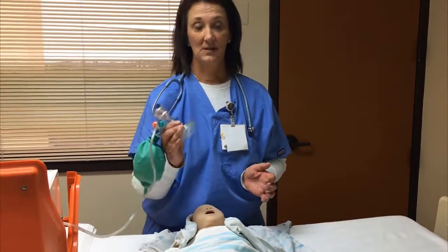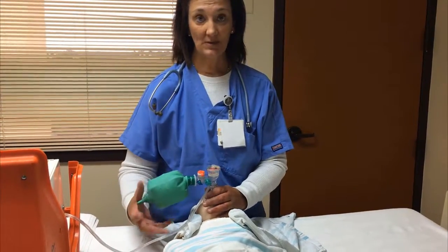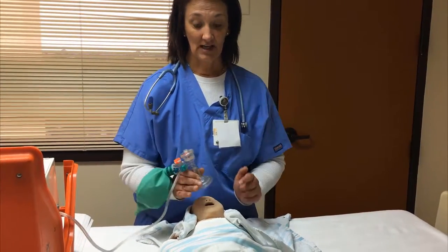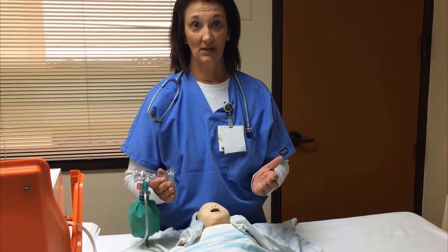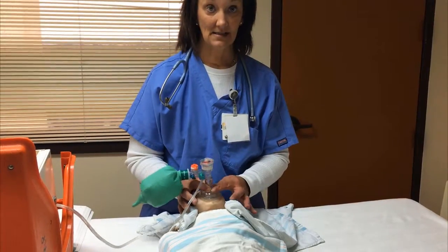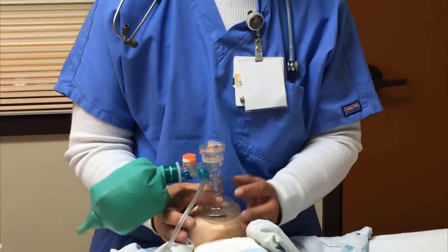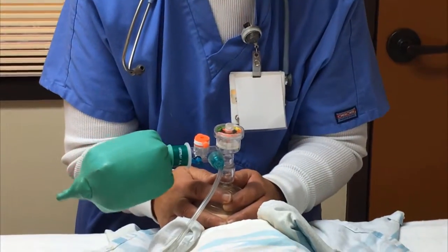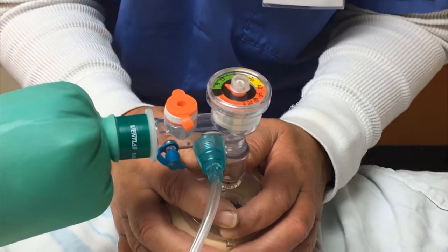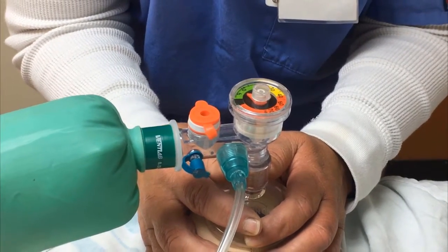So administering CPAP, we want to maintain a firm seal on the baby's mouth. We're not going to be giving respirations. All we're going to be doing is giving the positive pressure in between ventilations to ensure that the alveoli do not collapse. So we want to make sure that we have a nice tight seal around the nose and the mouth of the baby. We're going to use the two-handed technique, and we're going to ensure on our manometer that we have a PEEP starting out at 5, as you can see on this manometer.